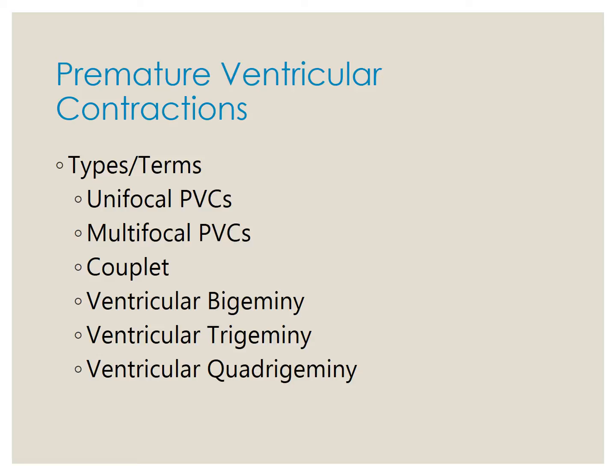Multifocal PVCs, there's several ventricular foci. It's a greater irritability. There's different looking PVC waveforms, and these are more dangerous. So again, multifocal, you'll be seeing PVCs that look different because they're firing from different areas of the ventricle that's causing these PVCs. Couplets are two PVCs together.